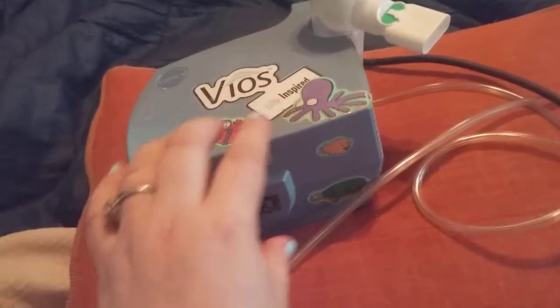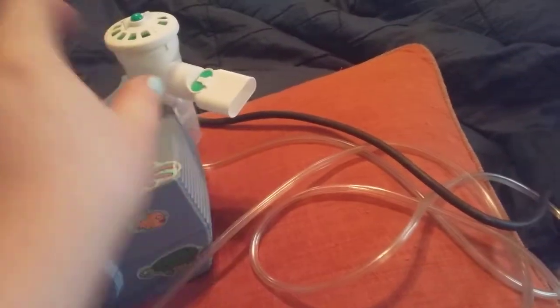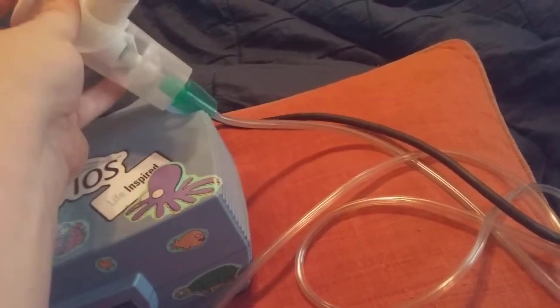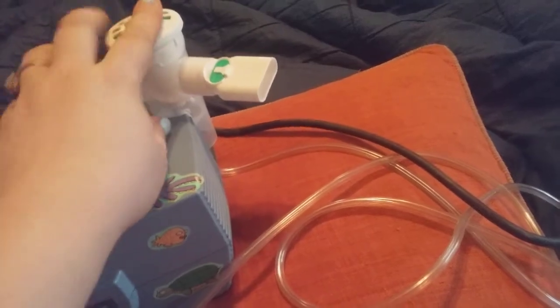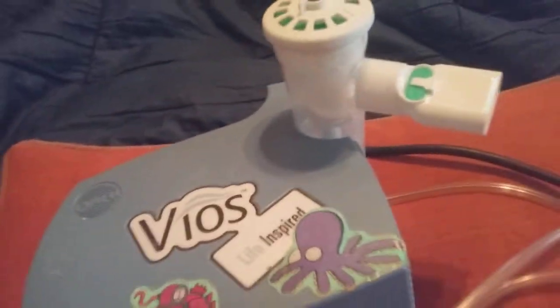This is the on and off button. That's off, and this is on. You plug your hose in here and it goes all the way up to here. And then you get this little cup — you unscrew it, and when you unscrew it, you put your solution in.